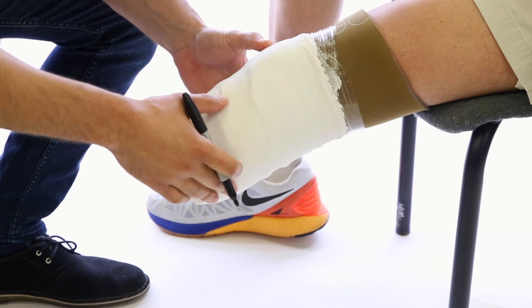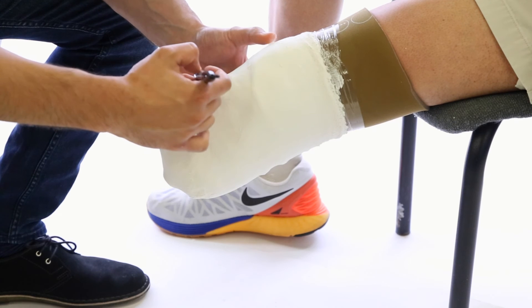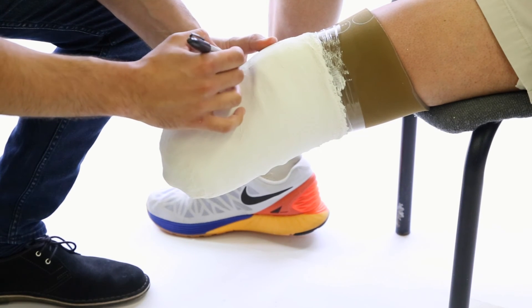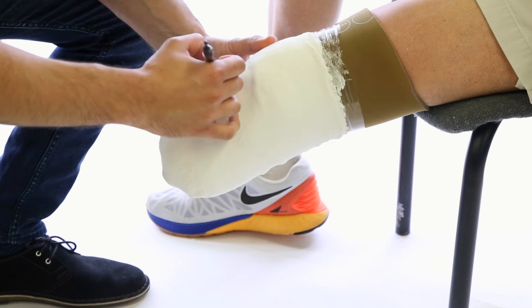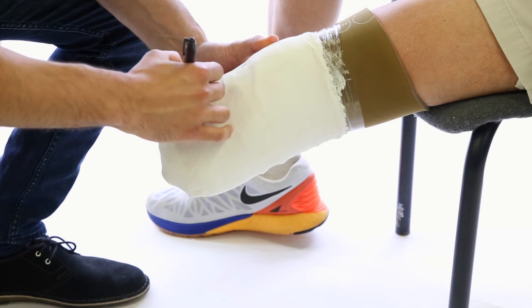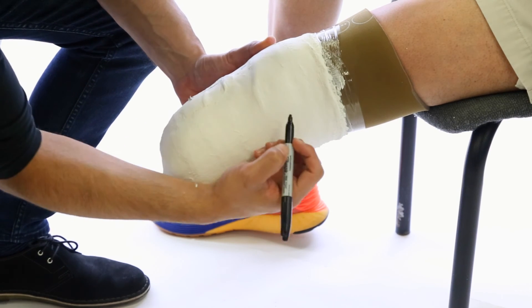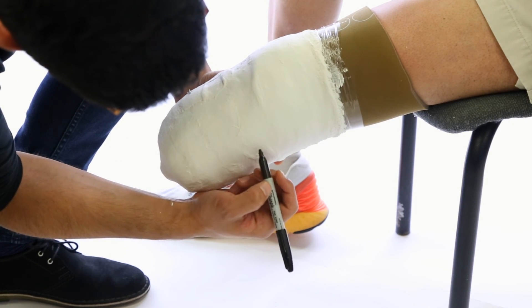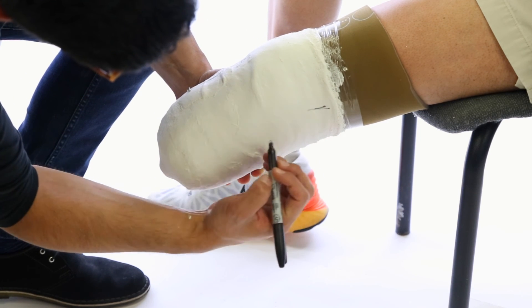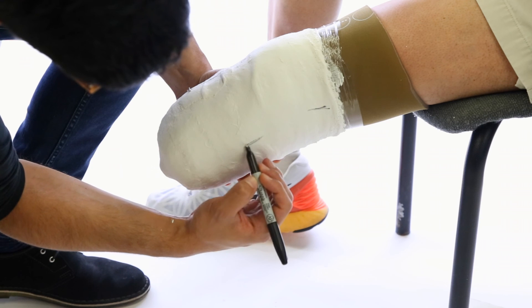Once everything is done and set, make sure to write your name on the cast, and also mark true anterior and the abduction angle as well as the lateral flexion angle by bisecting the femur and bisecting the tibia.